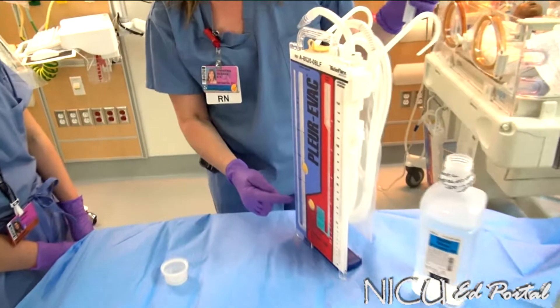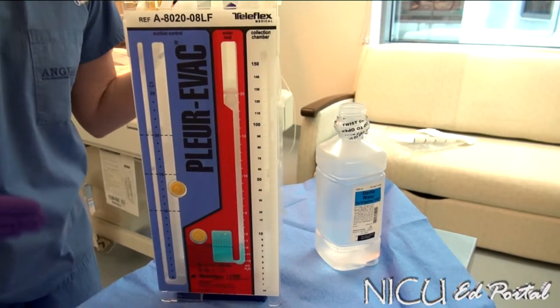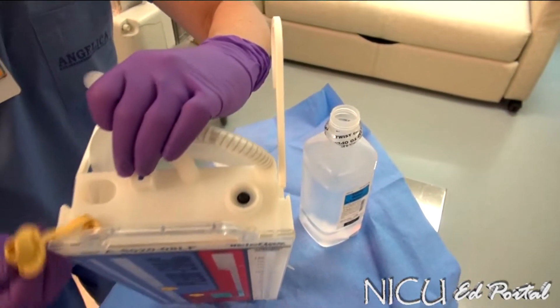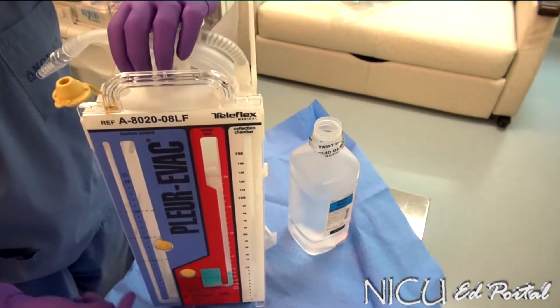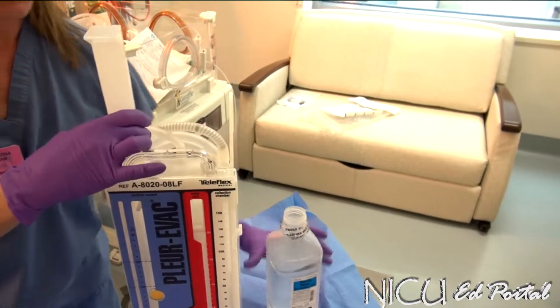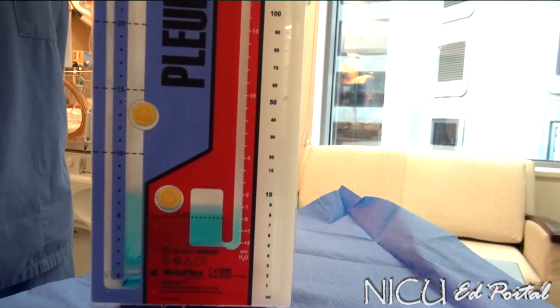The next chamber we'll fill is the centimeters of water suction chamber. This is what the provider orders — the centimeters of water. Usually it's 15 to 20, but you would confirm that with the order. There is a vacuum opening here — you pull that out, and that opening is where you're going to fill up to, let's say, the 20 centimeter mark. You can either pour it directly in or use the funnel.